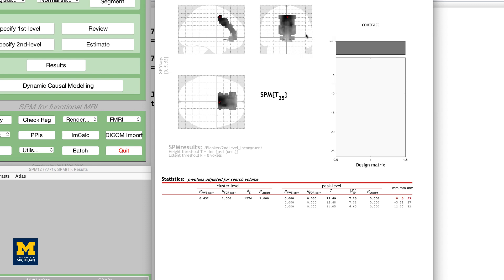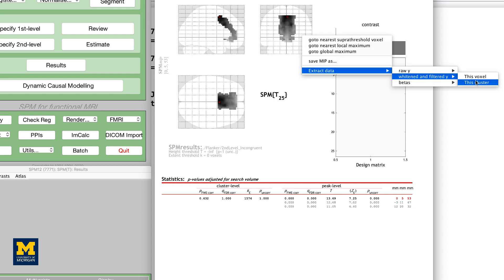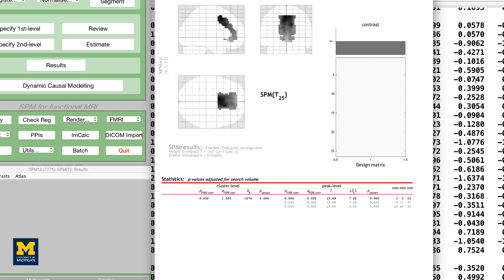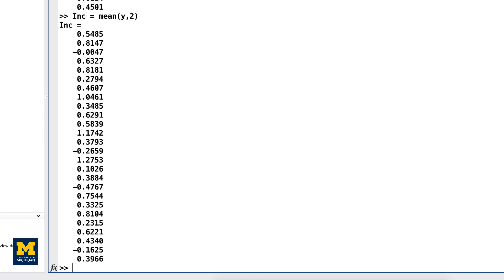Right-click in any of the glass brain panels and select Go to Global Maximum, which highlights the current ROI that you've created. Then right-click again and select Extract Data, Whitened and Filtered Y, this cluster. This will output to the MATLAB terminal a list of each contrast estimate for each subject, for each voxel in the mask. To make this list more manageable and easier to interpret, type: Inc = mean(y, 2). This returns a set of 26 numbers representing the contrast estimate for each subject, averaged over all the voxels in the ROI.